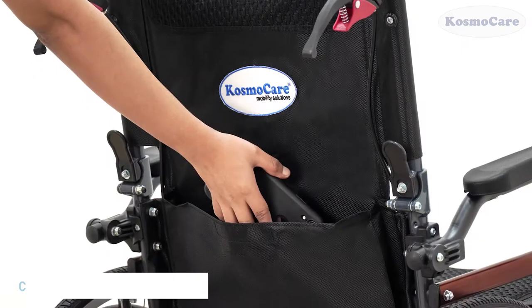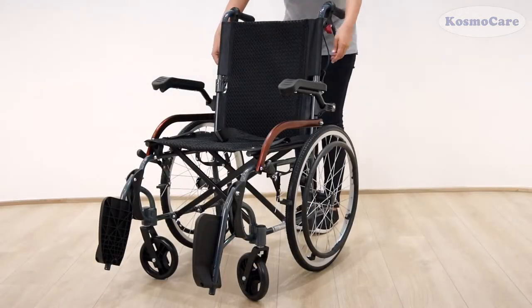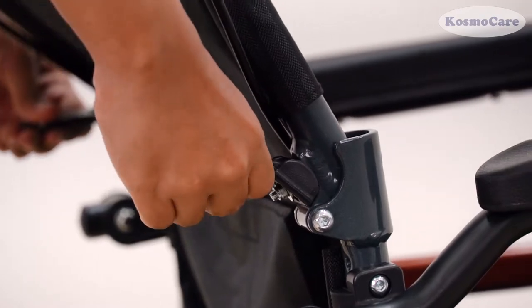Store your essentials in the back storage pocket provided while keeping your hands free. Folding the chair for transportation or storage is a breeze.